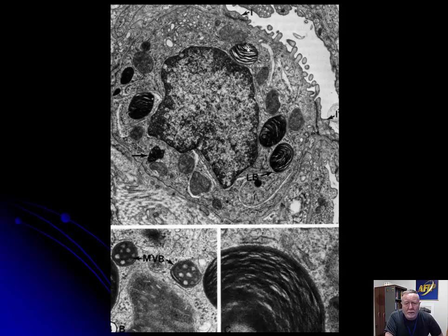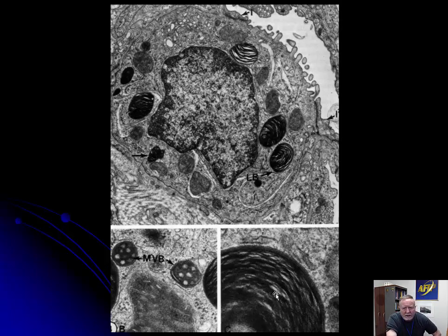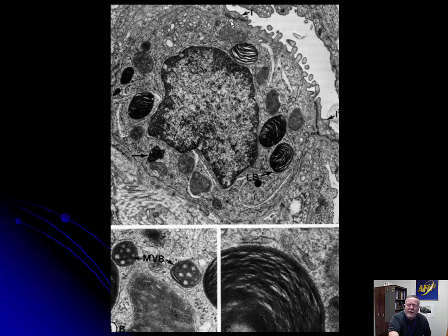Here are several pictures of type 2 pneumocytes. They are fairly typical epithelial cells with tight junctions and microvilli. They don't have a lot of organelles, but they are characterized by lamellar bodies or zebra bodies with lamellae of surfactant. There are also some multivesicular bodies — don't confuse those with surfactant; these are phagolysosomes that have incorporated effete parts of the membrane. The phagosome containing them will fuse with a lysosome and break them down, where they will live out their existence as lipofuscin granules within the cytoplasm.